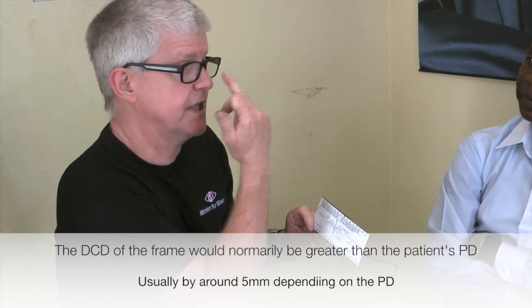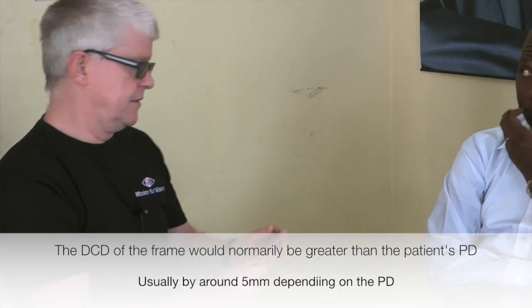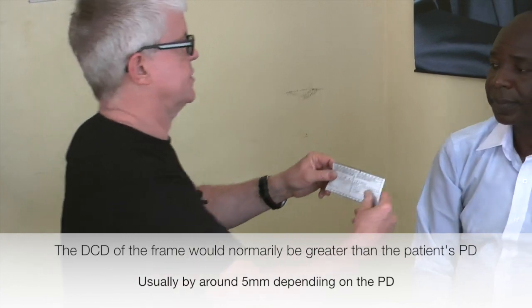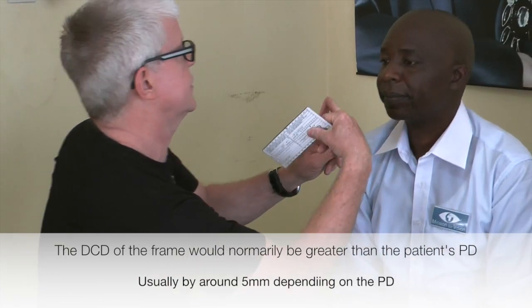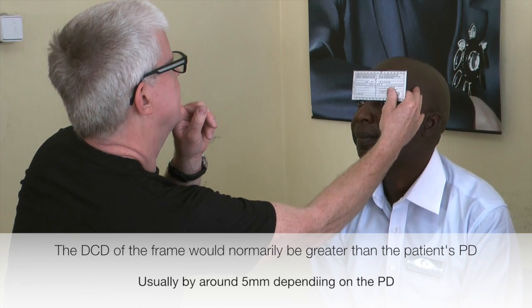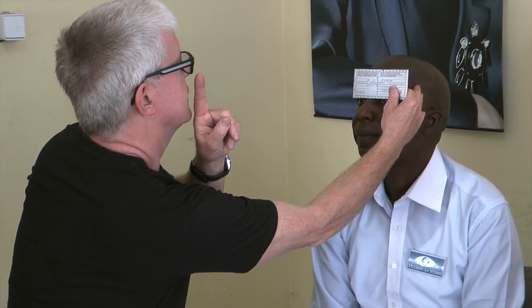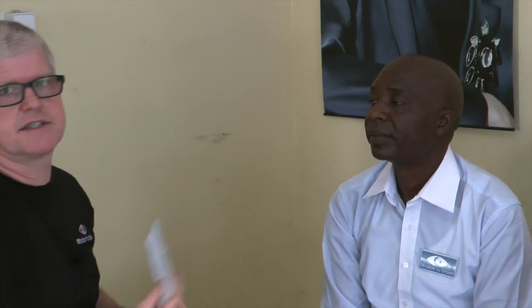The PD is the distance between their pupils. So I'm going to measure Remy's PD. If you could look at my finger and just follow my finger across. Remy's PD is 74 millimeters, therefore we need to find a frame which has a DCD of around 74 to 76.